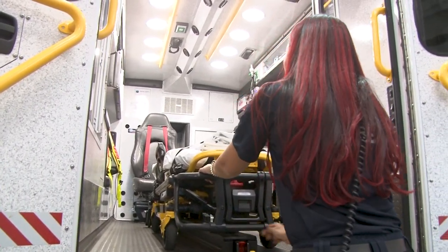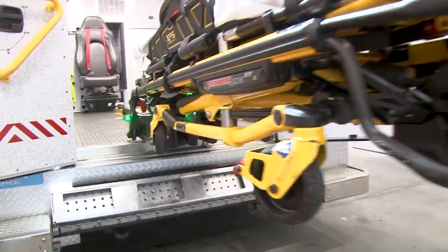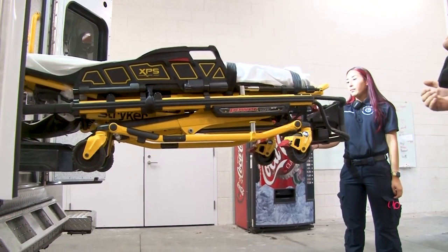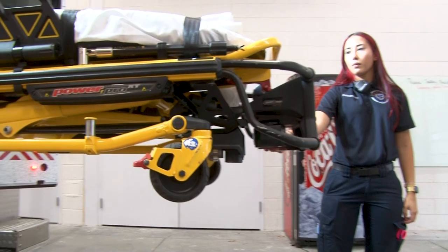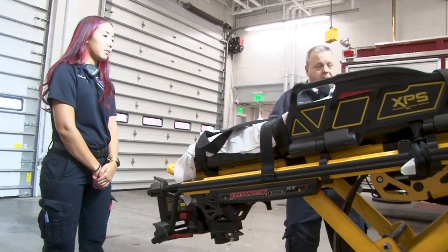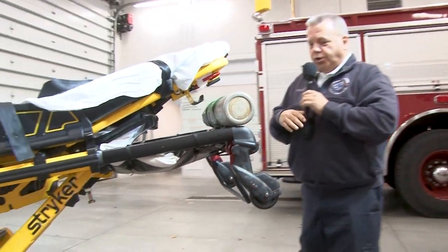So another feature on this ambulance that we're fortunate to have here in the city are these state-of-the-art Stryker stretchers. As you can see, we can take our hands off of the stretcher and the patient on it will be perfectly safe. It's hydraulics, it's all electrical. We're not holding it with our arms or using our backs and potentially injuring ourselves. At the touch of a button, she can lower the legs of the stretcher. So that once the legs are extended down to the ground, Andrea will unlock it from the ambulance and be able to wheel it right out and bring the patient into the emergency room.